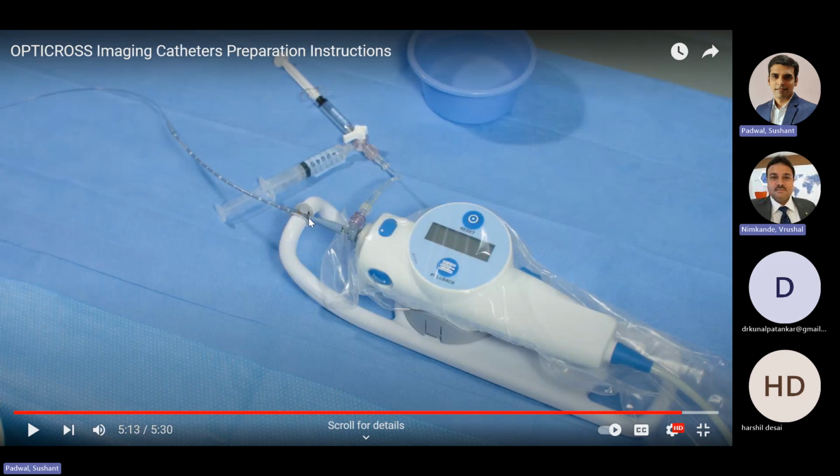They bring the transducer to the distal landing zone as per the angiogram, reconfirm on the IVUS whether that is a healthy segment or not, and from there they start pulling the MDU by pressing this lever locking switch when it is connected on the sled. And the moment the transducer comes to the proximal landing zone as per the angiogram, they stop it there.